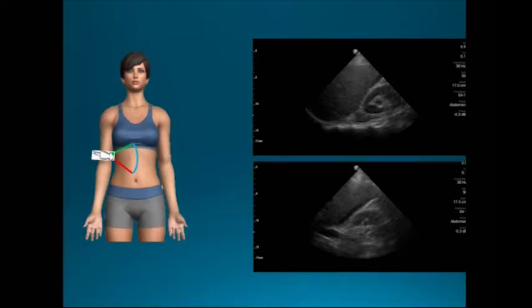And so shooting across here, based on what I told you before about the free fluid, you guys see this little bit of black right around here, right around her liver, in between the kidney and the liver. There's fluid there. I was like, oh, not good, right? And then, kind of also looking here, looking at her kidney. See how that doesn't look like a normal peanut M&M? There's a little black in there. She's got a little hydronephrosis on that kidney. It was not present on the other side.